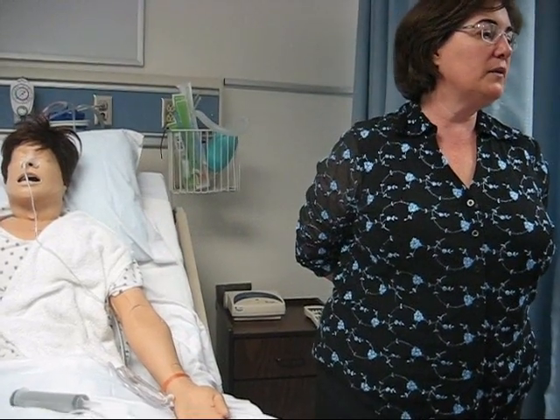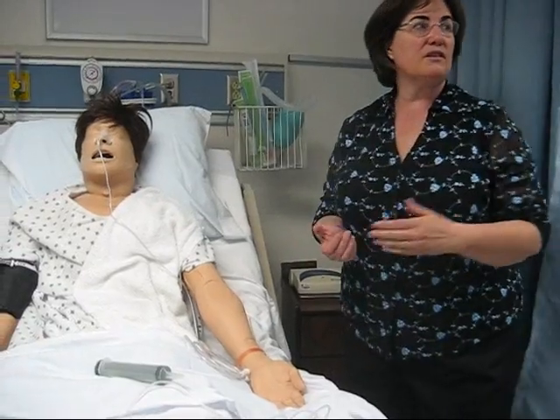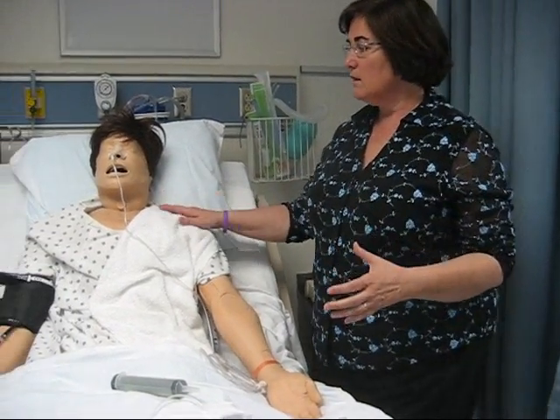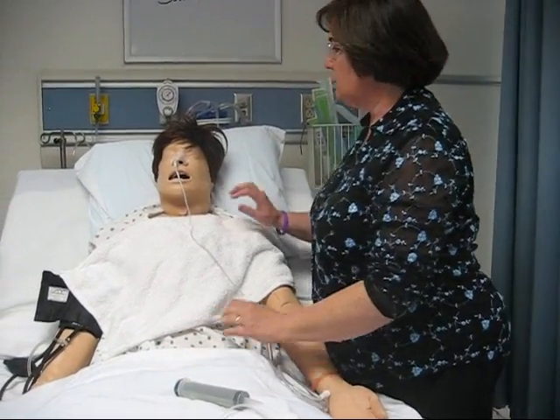All right, and it has the critical behaviors in the beginning, where you go and check the doctor's orders, wash your hands, and assemble the equipment. All right, but what NANDA diagnosis are we actually referring to here? What nursing diagnosis applies when somebody is being fed artificially?